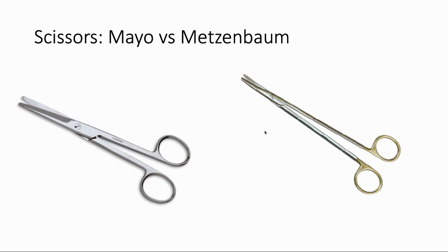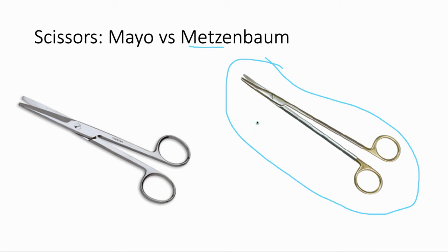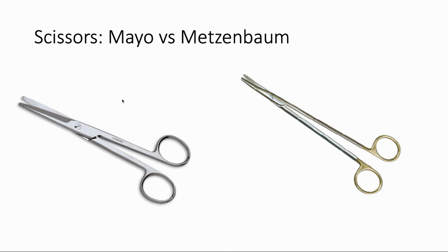Scissors. As a medical student you'll mostly be dealing with Mayo scissors — over here on the left — with blunter tips, hardier scissors, great for cutting sutures and heavy-duty things. The Metzenbaum scissors, often referred to as just Mets, are more delicate scissors used for very fine dissection and lysis of adhesions. Your scrub tech will probably get angry at you if you use these fine scissors to cut suture and dull them — you want to use the heavy Mayos for something like that.